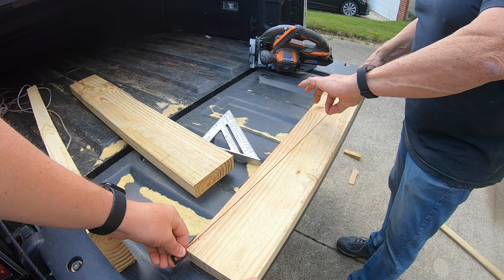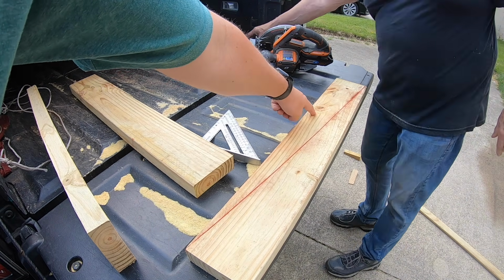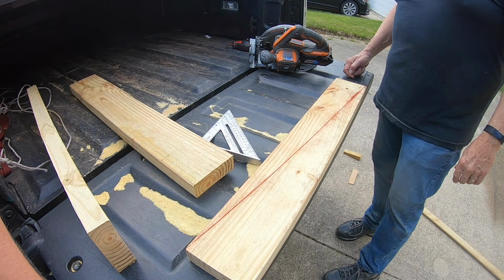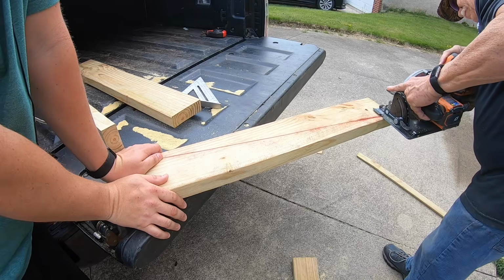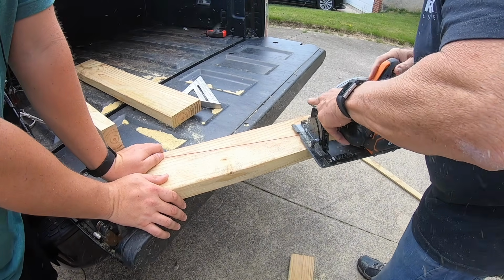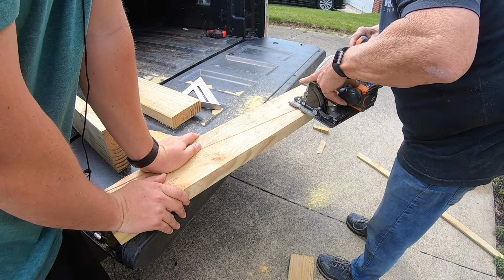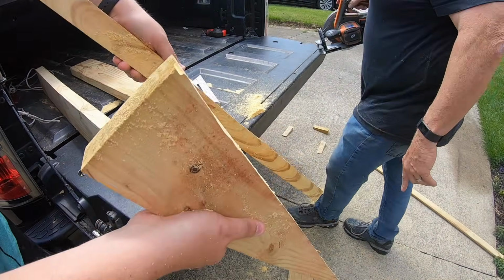This will allow the board to be cut. And one thing you will notice, there's a couple of knots over here. We're not gonna use that side, we'll actually use this side just because it's a little bit better piece of wood. So he's gonna go ahead and cut halfway down, and then we'll flip it the other way and let him cut the other half. And that right there is it.